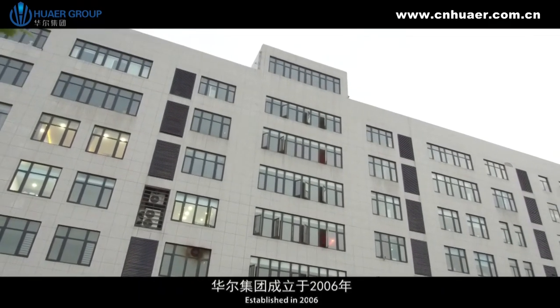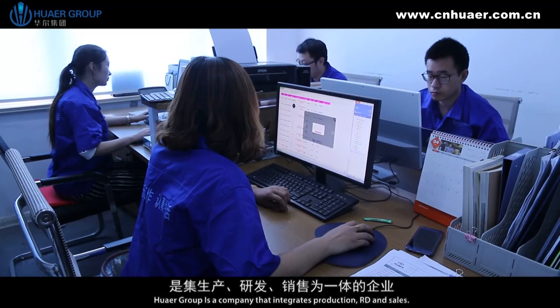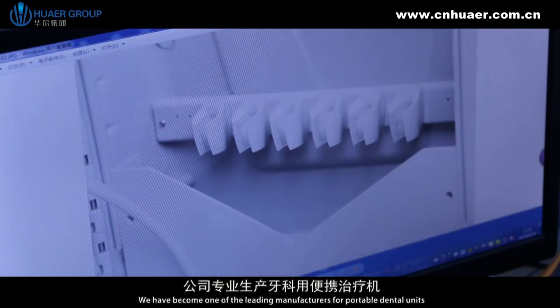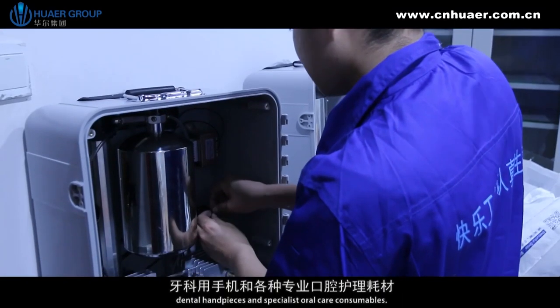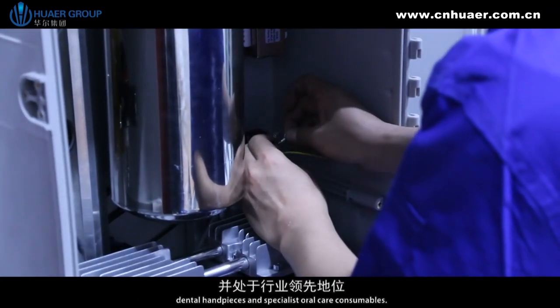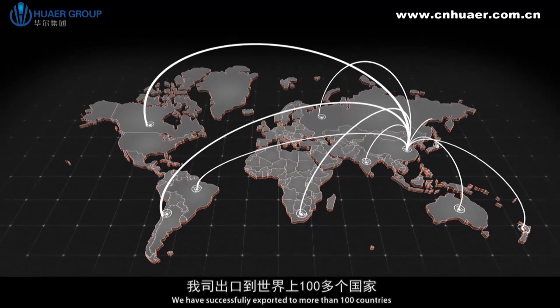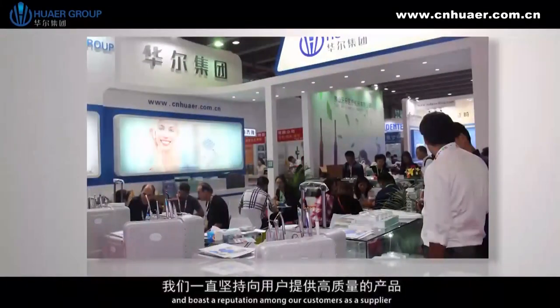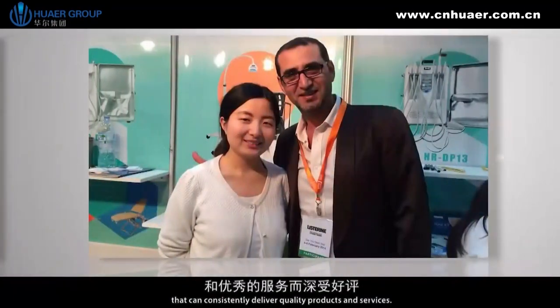Established in 2006, Huaer Group is a company that integrates production, R&D and sales. We have become one of the leading manufacturers for portable dental units, dental handpieces and specialist oral care consumables. We have successfully exported to more than 100 countries and boast a reputation among our customers as a supplier that can consistently deliver quality products and services.